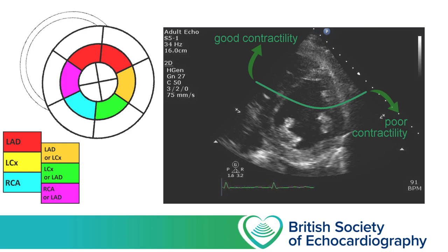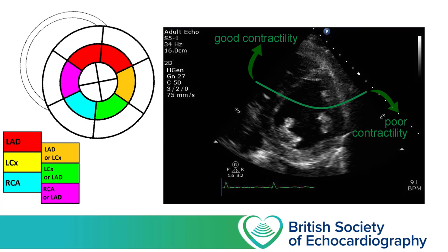Let's take a look at an example. In this parasternal short axis image at the mid-level, the anteroseptal and anterior segments have the best function, whilst there's very little thickening or motion in any of the other segments. This is from a patient with a previous inferior myocardial infarction who has acutely occluded their left circumflex, and is entirely dependent on segments supplied by the LAD for their LV systolic function.